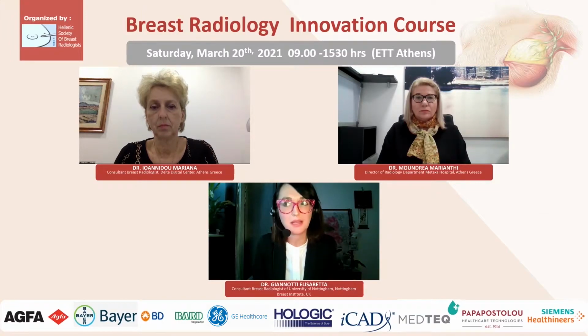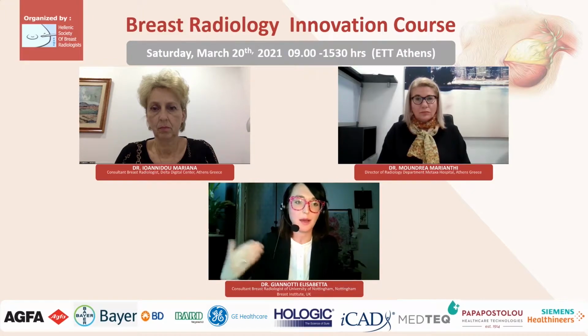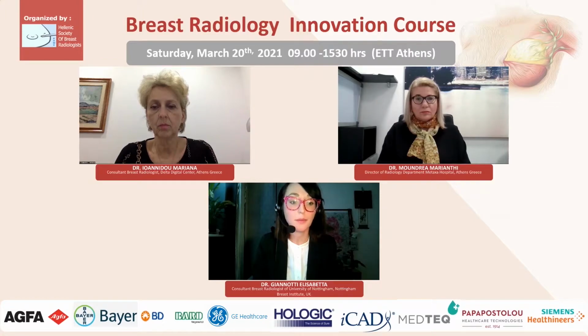The principle is basically physics: in contrast mammography the signal is proportional to the amount of contrast, while in MRI it is about the intensity in the T1 picture. So I think we can say it is better than standard mammography, but I would be interested to look into it in comparison with MRI.